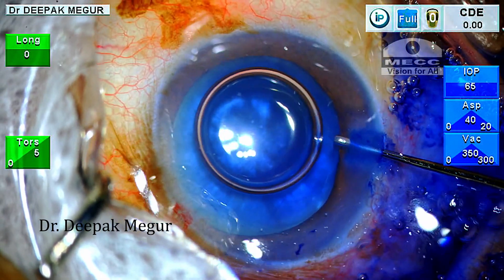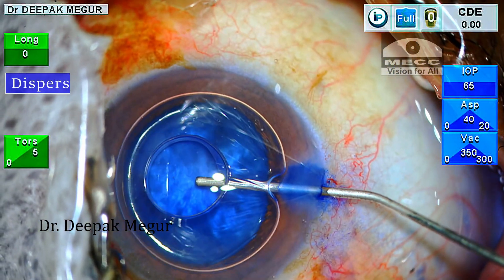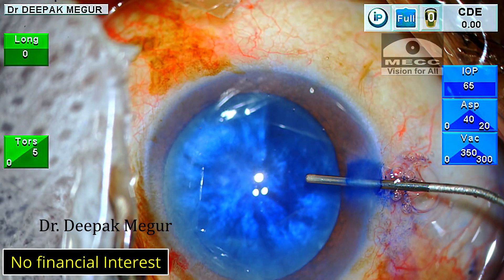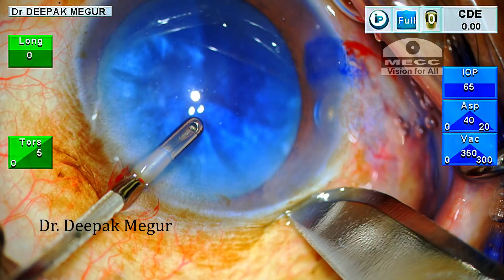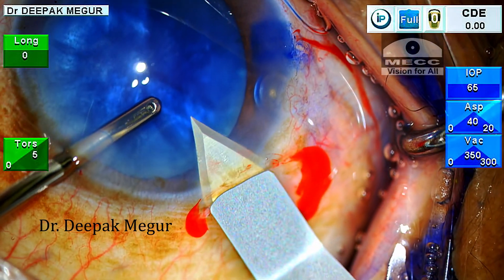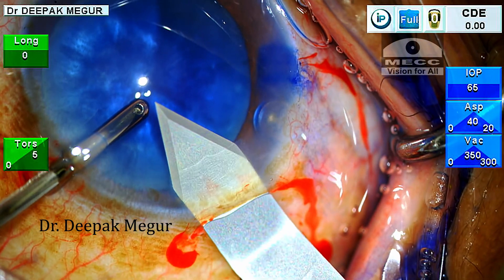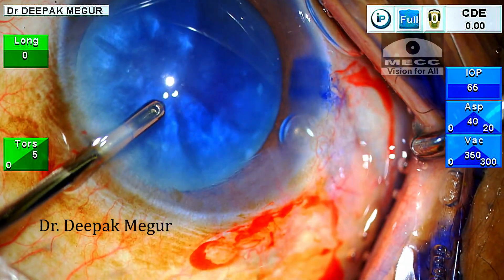After viewing the anterior capsule, I prefer to use dispersive OVD. Aurocote is the brand I am using here, which has a combination of sodium hyaluronate and chondroitin sulfate — something like Viscoat. The main 2.8 mm incision is created with a bevel-up keratome.